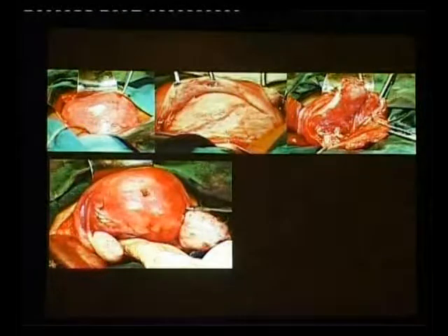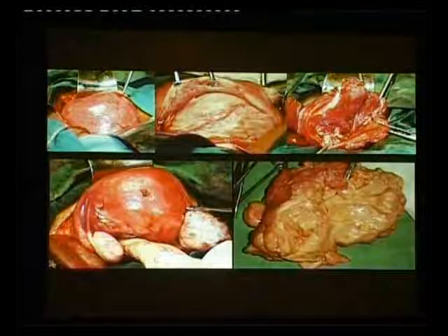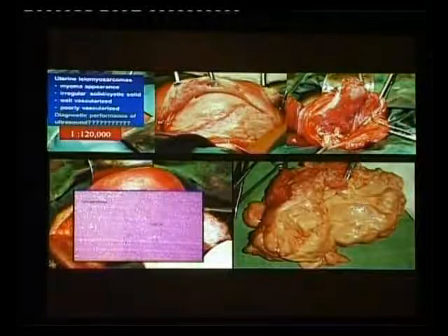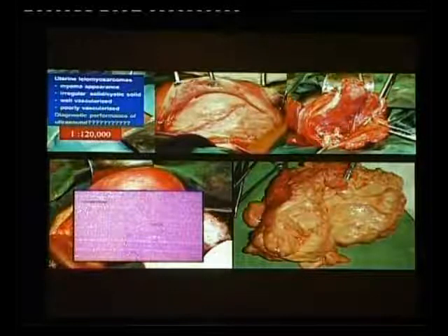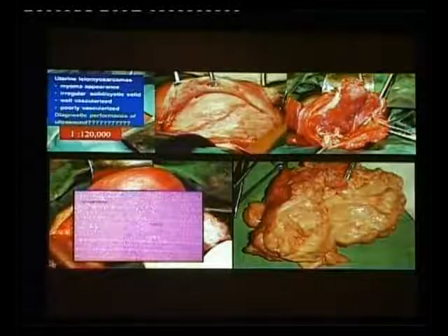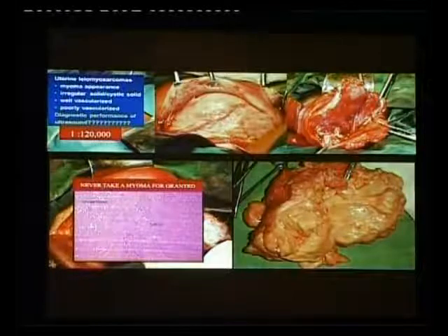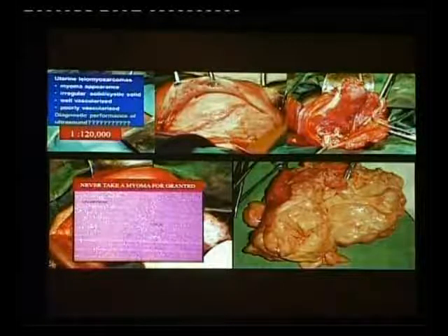were very happy with what we did, till we cut the tumor after the surgery was over and found solid and cystic areas. The report, to our surprise and shock, came as a sarcoma. We know that we see 1 in 120,000 sarcomas. You can see a sarcoma cannot be diagnosed very clearly on ultrasound, particularly if it is not very vascular. So what is the moral of the story? The moral of the story is never take life, your husband, and a woman's myoma for granted.